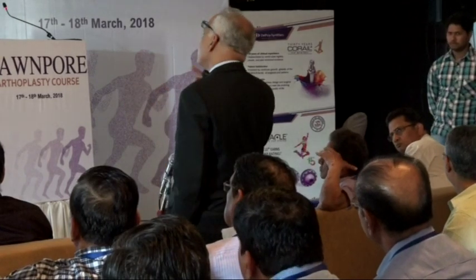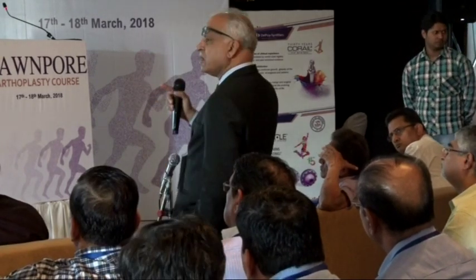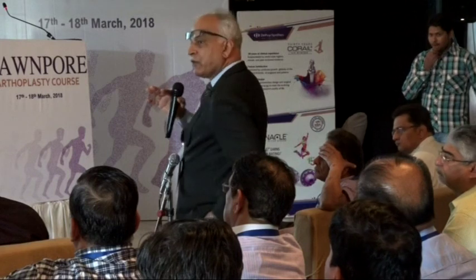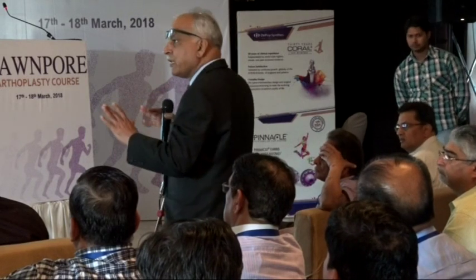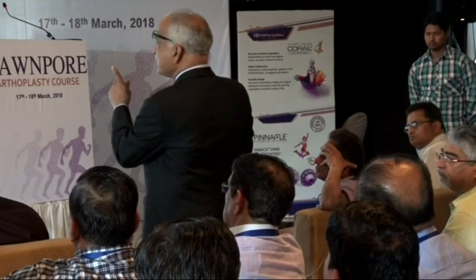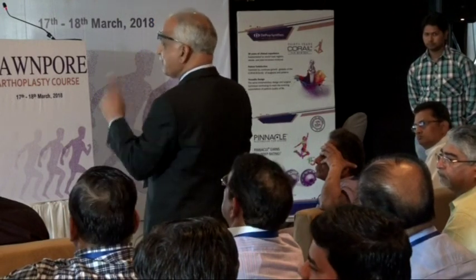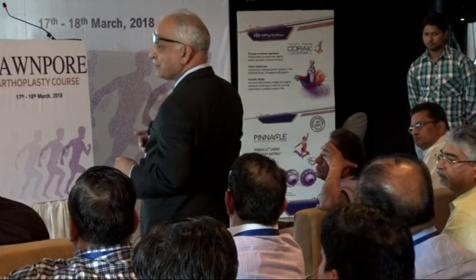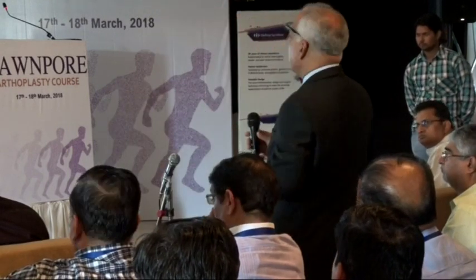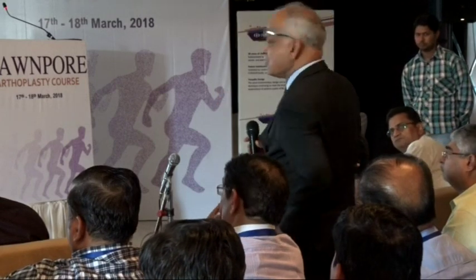Later on, everything is going to become more difficult. Now removing everything and doing even a hinge is going to become a terrible job. So I would rather take a decision at the trial stage. If I don't have an implant, I'll close the wound there, tell the patient I'm going to come back tomorrow morning again. But once I fix implants, then to revise it is a Herculean job. Even a hinge may not give you the right result. So that's my approach on day one if I was stuck like that. Now of course there is no other option but to use it.